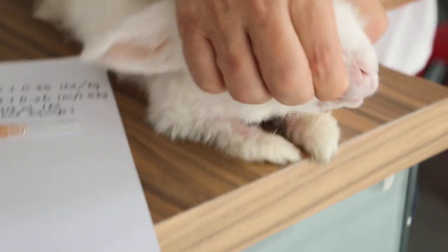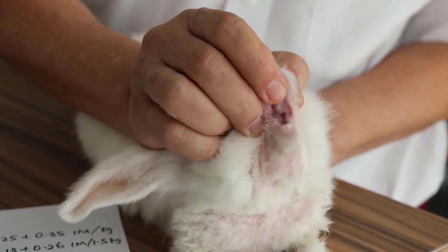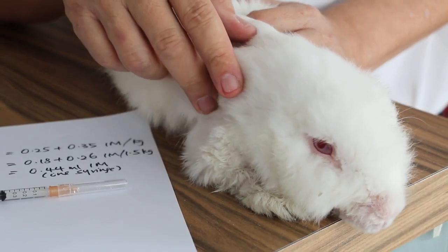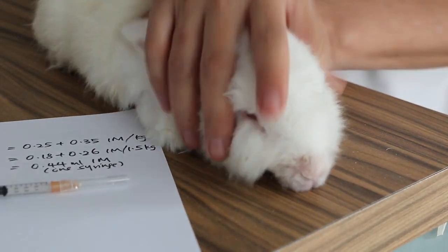Then after that, we open the mouth and check the molars for molar spurs. Then I will trim the molar spurs — the sharp ends. And after that, there should be no more drooling.